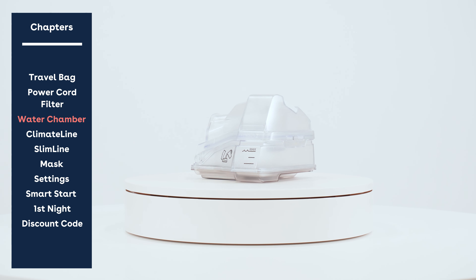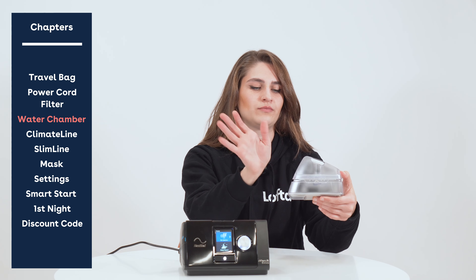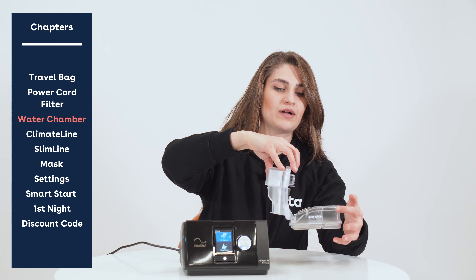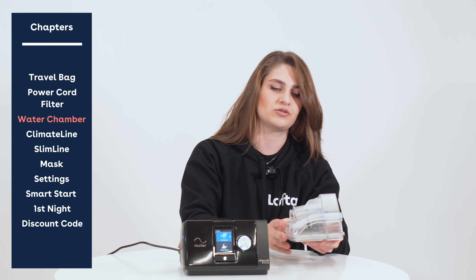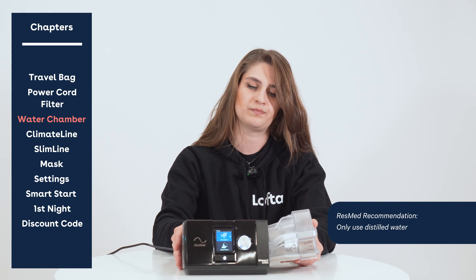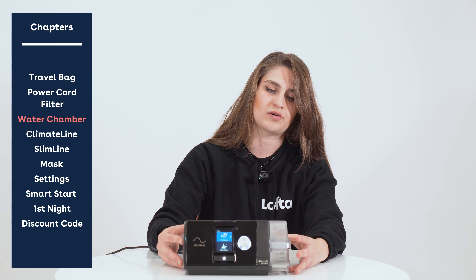The next thing we have is our water reservoir — sometimes called the water chamber or humidifier. We're going to fill it up with distilled water nightly to the maximum fill line, and we recommend dumping out any excess water in the morning so you're not accumulating unnecessary bacteria. ResMed does want you to fill this with distilled water. When you insert it you should hear it click into place and feel it fully inserted.